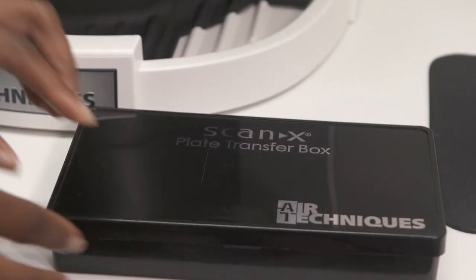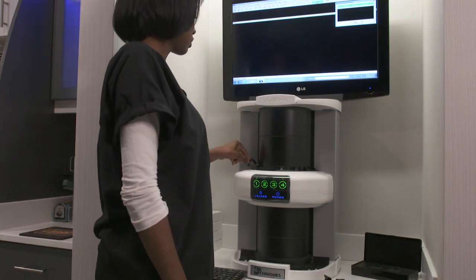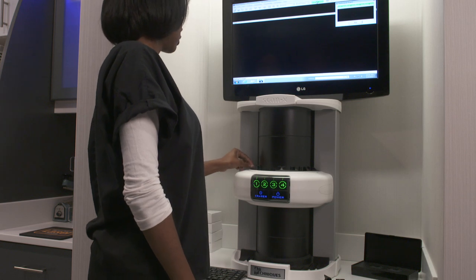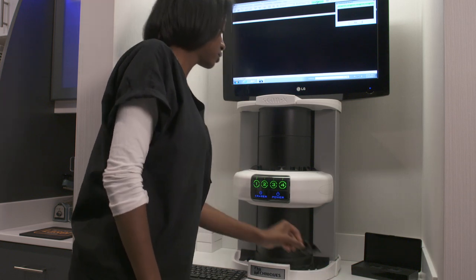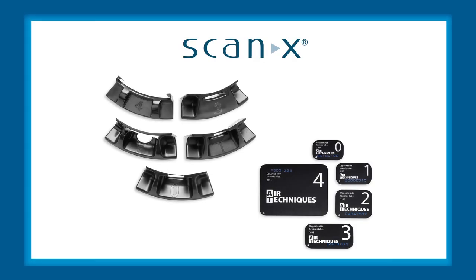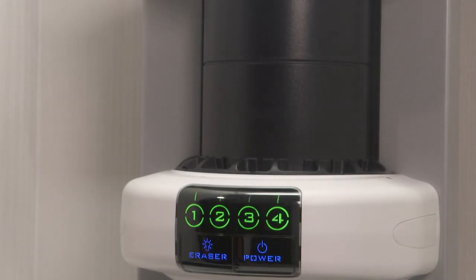Now you're ready to scan the flexible sensors. Since we're using size 2 flexible sensors, we will use size 2 plate guides. Insert the guides onto ScanX. If you need to scan differently sized intraoral imaging sensors at the same time, choose the appropriate plate guides and insert them simultaneously. Use your imaging software to activate ScanX and choose the image type and resolution you want. When ScanX is activated, the 4 LEDs will illuminate green.